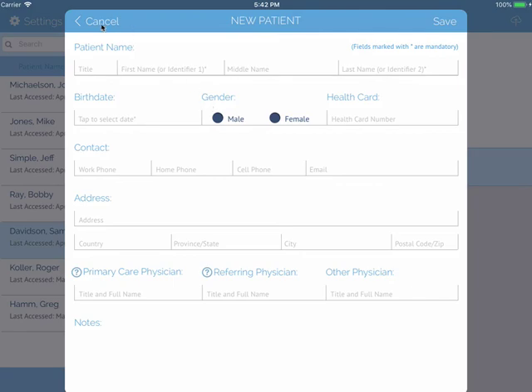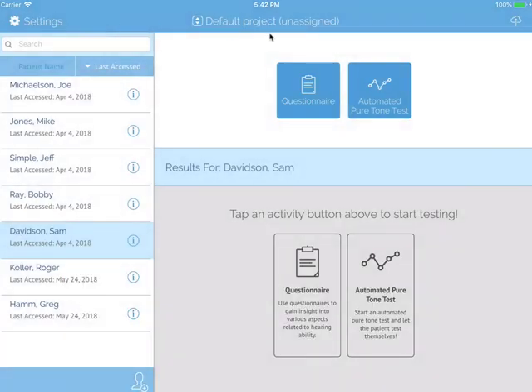The testing types you can perform on Shoebox Audiometry are an automated pure tone test and a questionnaire.